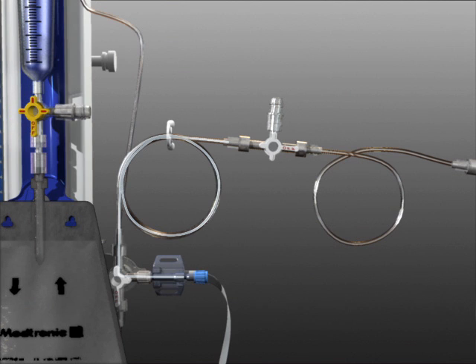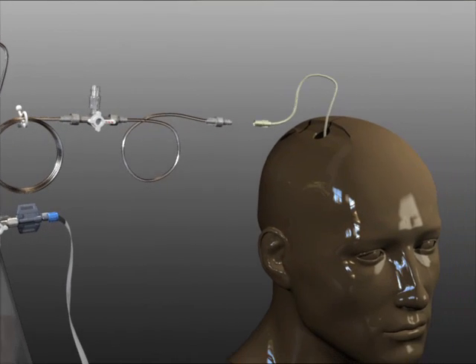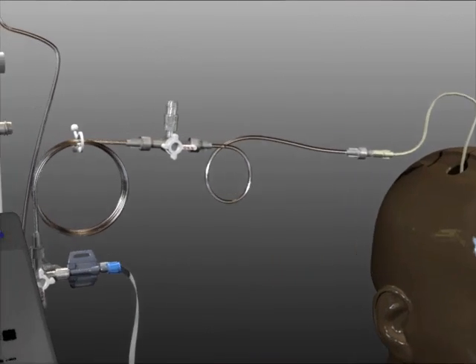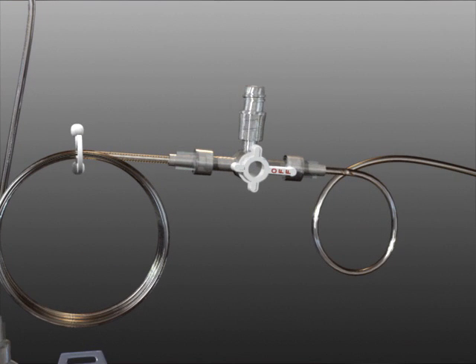Using sterile technique, attach the patient's catheter to the end of the patient line. Be careful to prevent air bubbles from being introduced into the patient line.